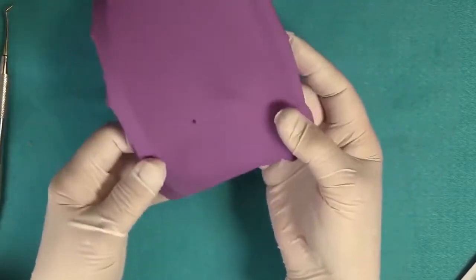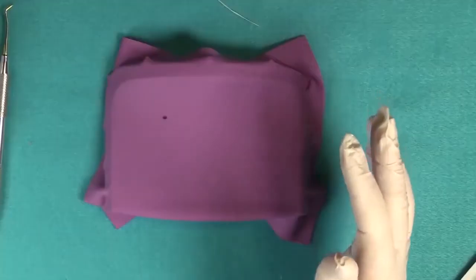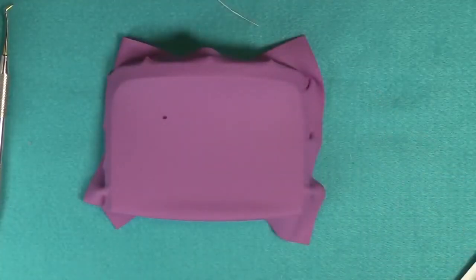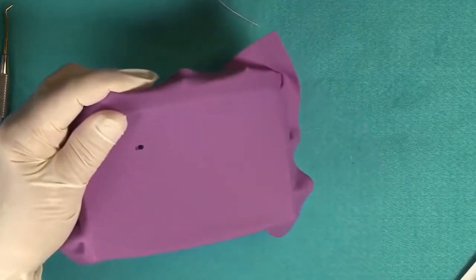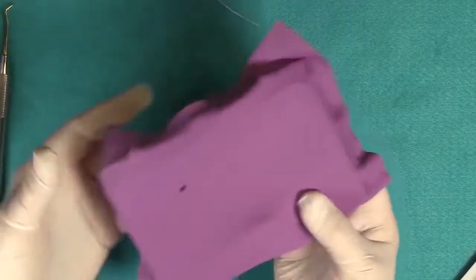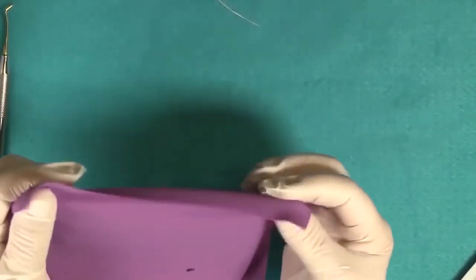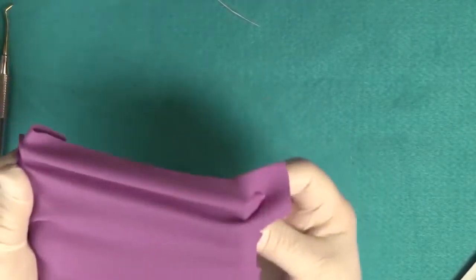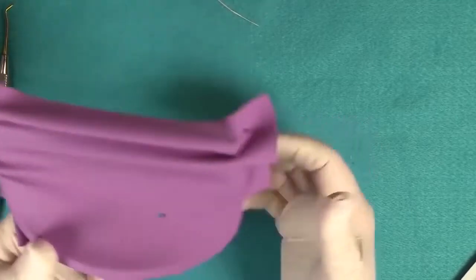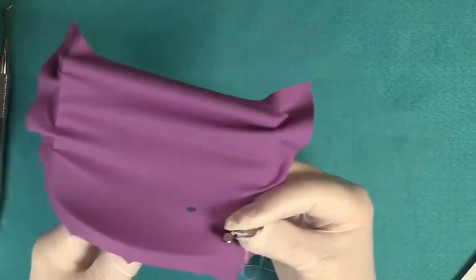So once you have your dam in place and you have it on the frame, it's actually much easier to punch your dental dam when it's on the frame. See? Otherwise, you could punch it off of the frame, but it's flopping. And you can actually make it so that it's not so taut. A little bit of leeway there. And there's 2 ways you can insert the clamp into the dam.